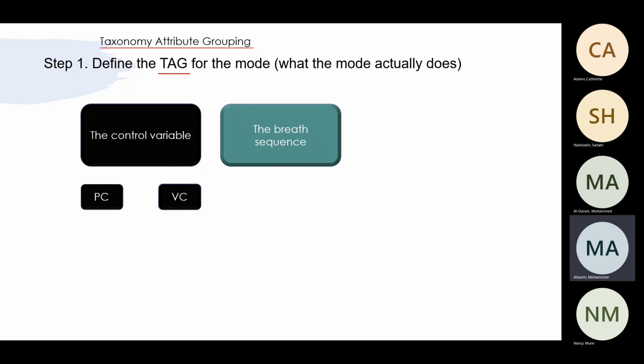What does that mean? Like in the last lecture, the breath sequence is the patient taking control. He's initiating the breath and ending the breath. Or is the machine the one who's initiating or ending, or both? There's a control for the machine, or it's intermittent. Some of the breaths the patient will control, some will be controlled by the machine. That's why we have three main categories.